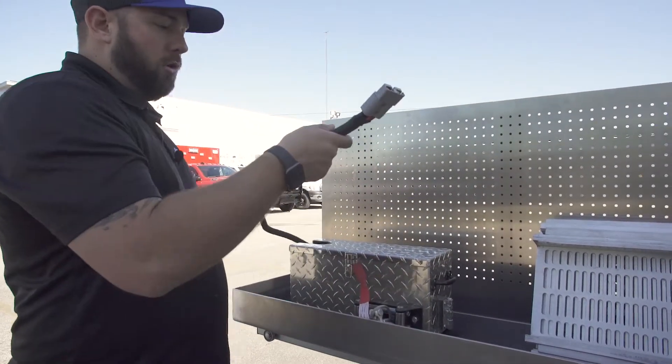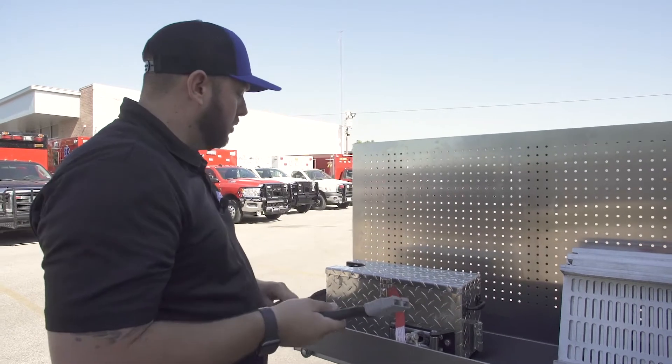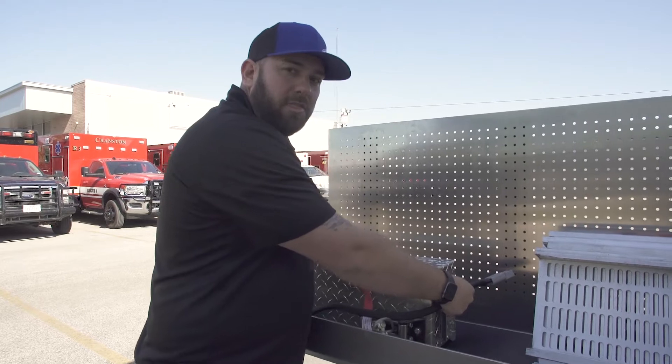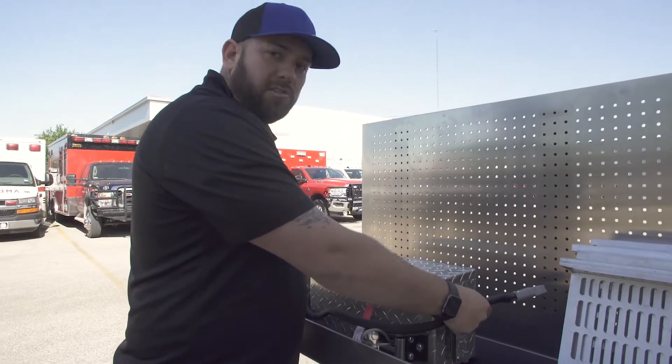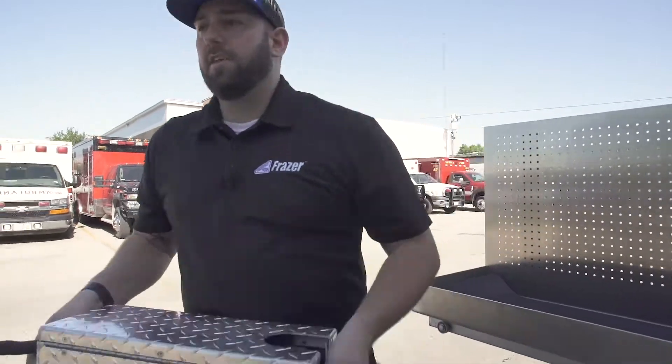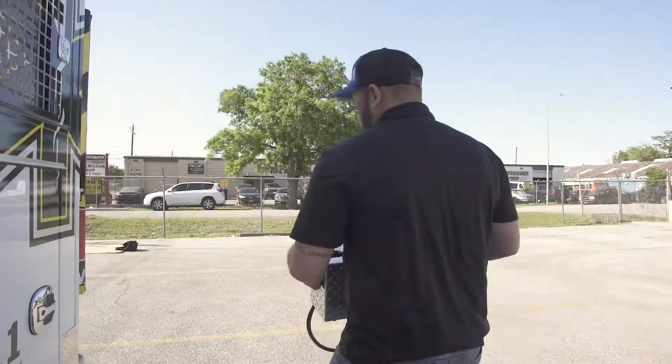The power cord kind of dangles, so you're going to want to keep control of this. There are two handles, one on each side of the box. This weighs probably 30 pounds or so, so you want to be careful how you're lifting it. Lift it out of the tray, and then walk it to the rear of the vehicle to the inside.